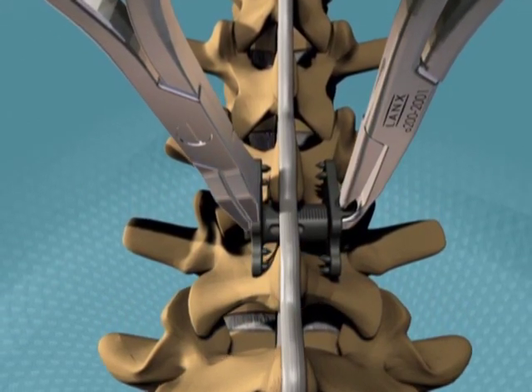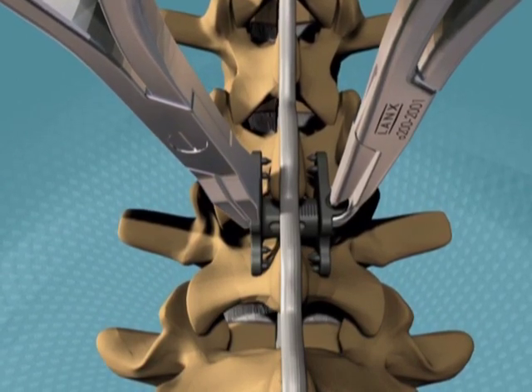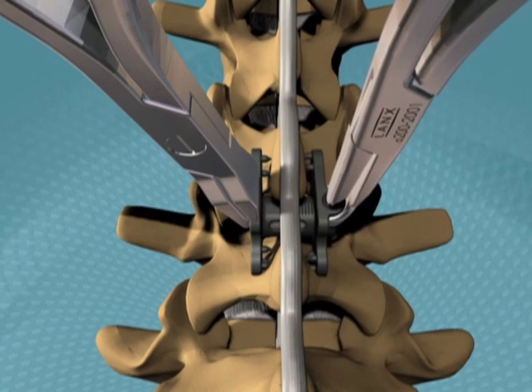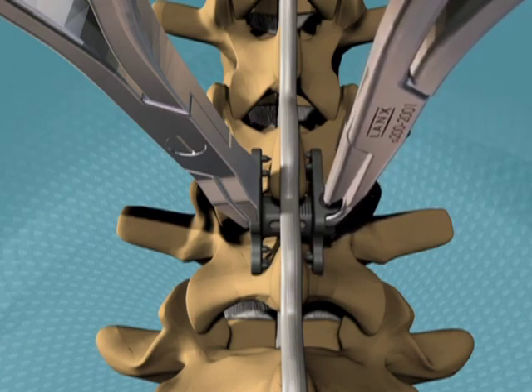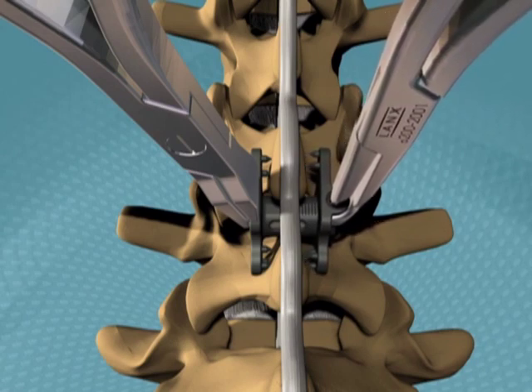Slide the corresponding lock plate over the plate post until it comes in contact with the spinous processes. Before compressing the plates and tightening the set screw, ensure the device is placed as far anteriorly as possible and that the plate does not protrude above the lumbodorsal fascia. Also ensure that the fixation spikes have securely engaged both spinous processes. The lock plate will angulate up to plus or minus 10 degrees in the coronal plane to accommodate the bony anatomy.